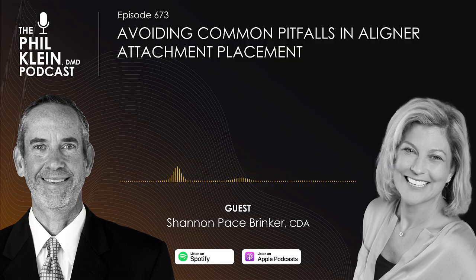but you don't need that much. And the beauty of using the adhese pen is you're scrubbing it into these areas and it has its own little tip. So when I etch, I'm only going to etch the area where the attachment is going to be placed, but I'm also going to precisely place the bonding agent right where I etch.